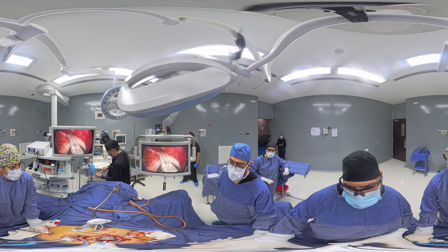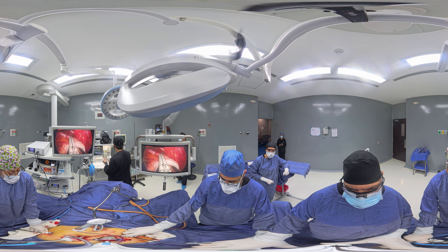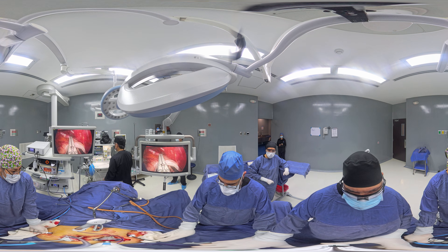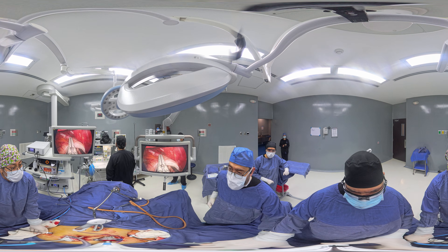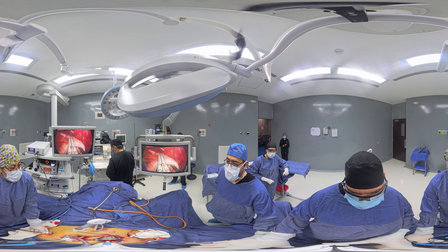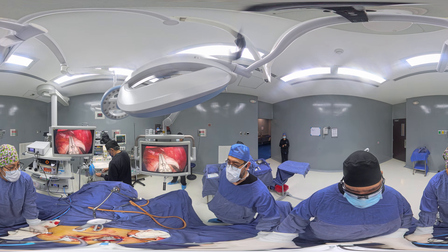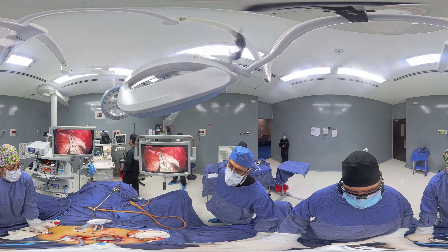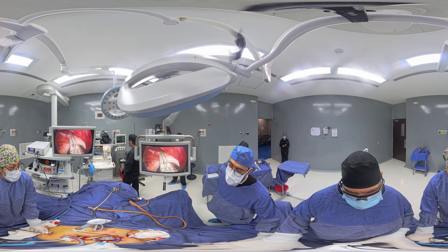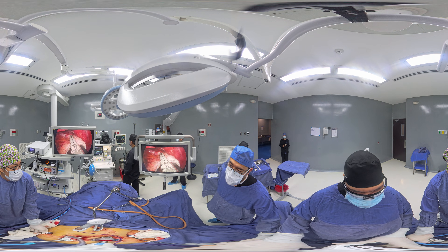We are pausing right now because when we create compression on the stomach, in some patients that are very sensitive, there is a nerve that goes through the GI tract called the vagus nerve. This very commonly produces bradycardia, which is low heart rate, which is what's happening right now. The anesthesiologist is adding a little bit of medication to bring those numbers up, and once it's more stable and safe, we will proceed.